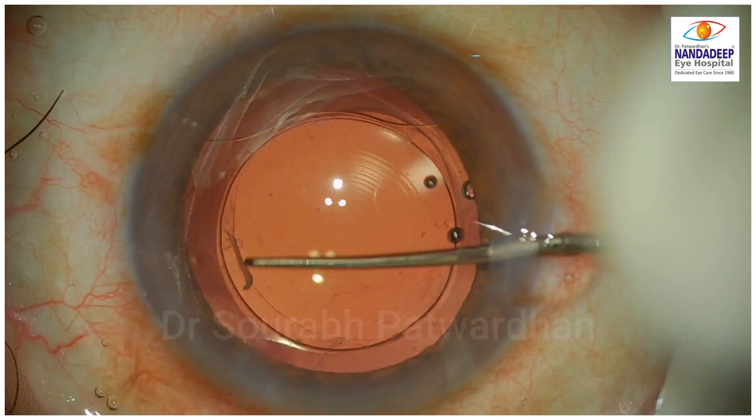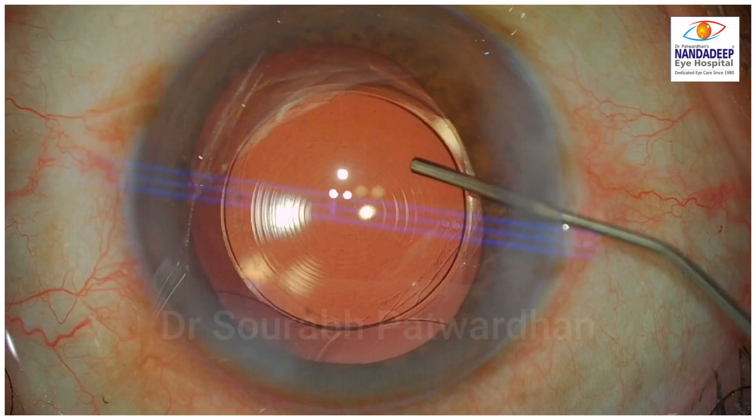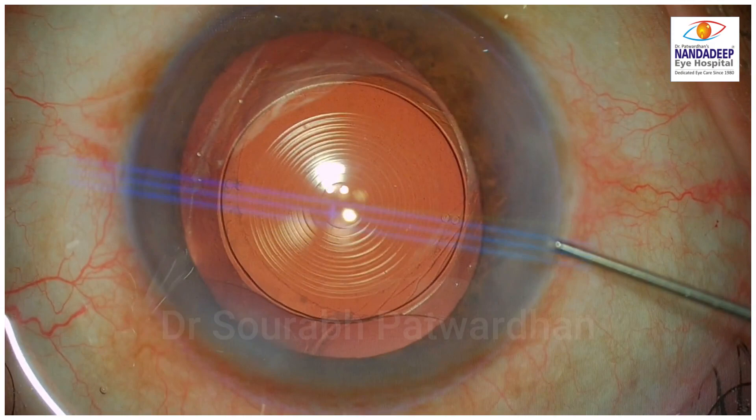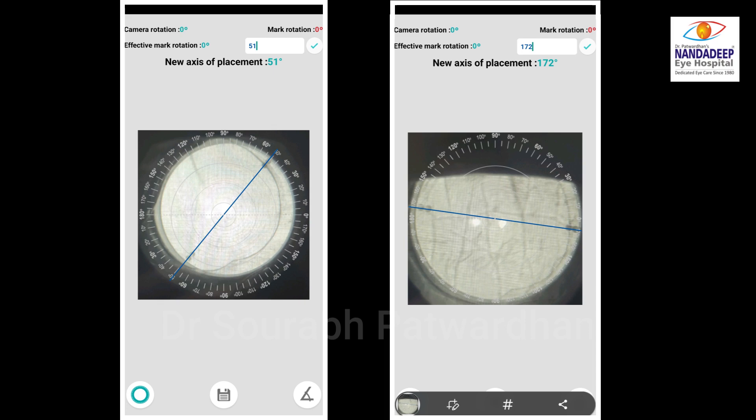You can see I have rotated the IOL to 176 degrees — the target final axis — and the OVD has been fully aspirated. Immediately post-rotation, using the iToric app and an image from the autorefractor, the axis is confirmed at 172 degrees, which is just 4 degrees off from the intended 176 degrees — which is acceptable.